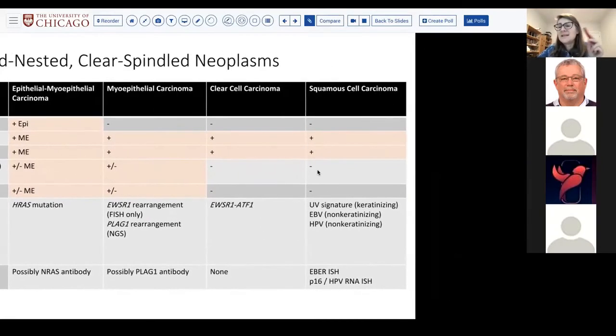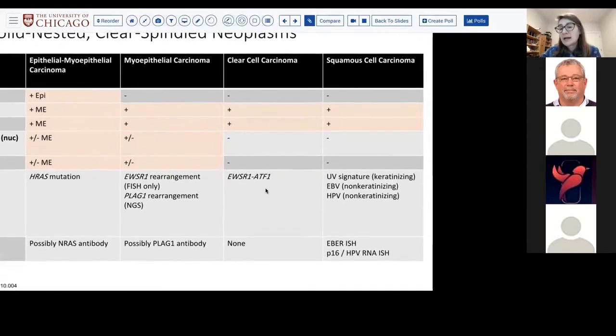But if you have something that is immunophenotypically essentially identical to squamous, you might want to think of clear cell carcinoma of salivary type, formerly hyalinizing, that generally tends to be a little lower histologic grade, have wrinkly nuclei, sometimes have clear cytoplasm, but sometimes have pale eosinophilic cytoplasm, stains like a squamous, but has, as you know, the diagnostic EWSR1-ATF1 gene rearrangement, right?